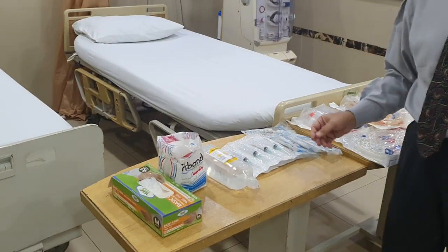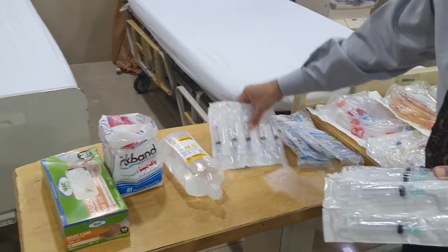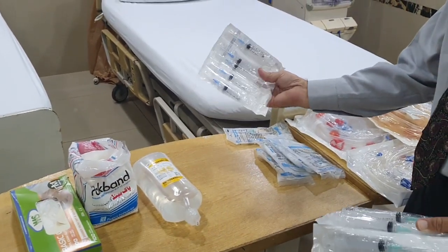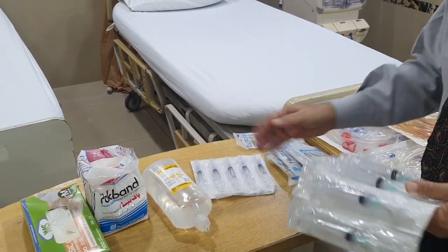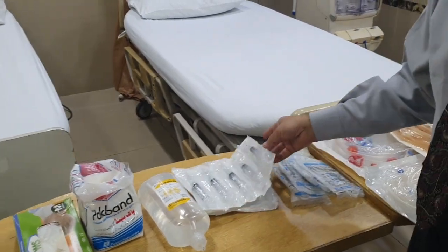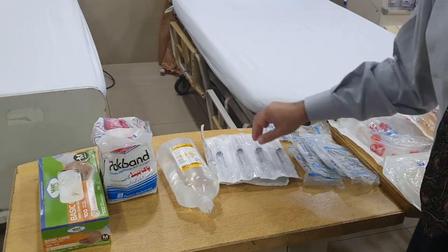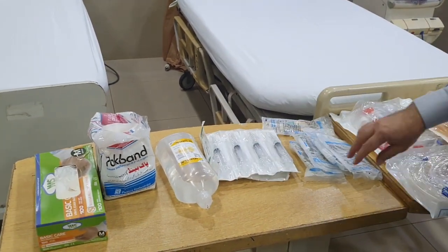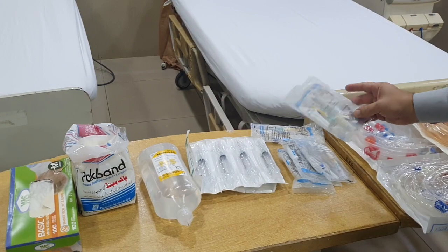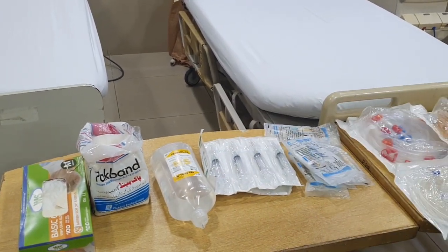One of the major complications of dialysis is hypotension. It remains there. The syringes, once again, there are different syringes. You've got the 5cc syringes, which obviously have a blue needle, and then you've got the 10cc syringes with a green needle. The needles are interchangeable. It depends really on your preference. It doesn't matter which ones you use, but you need several of them during a dialysis session. So this is a standard IV drip set, which is required for this. There is nothing special about it.